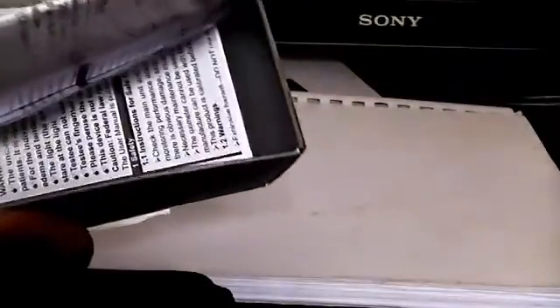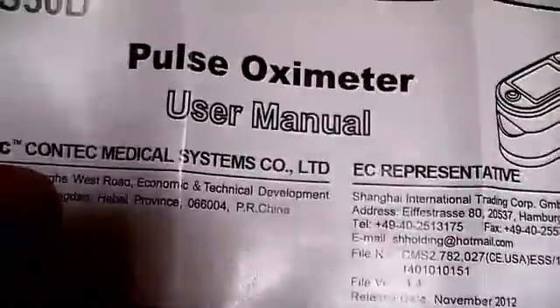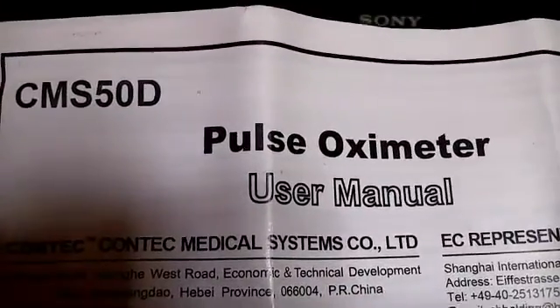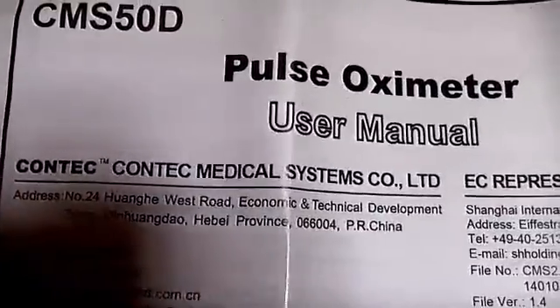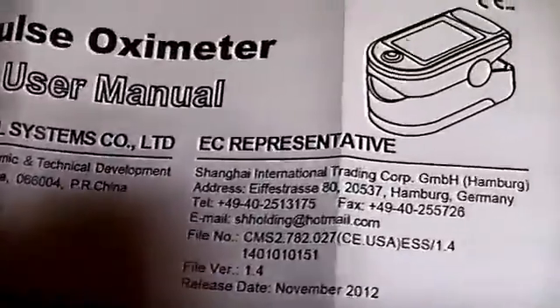That's a strap, or whatever you'd call it. We have a manual inside. It says CMS50D, data model number, pulse oximeter user manual — Contec Medical Systems, address China.